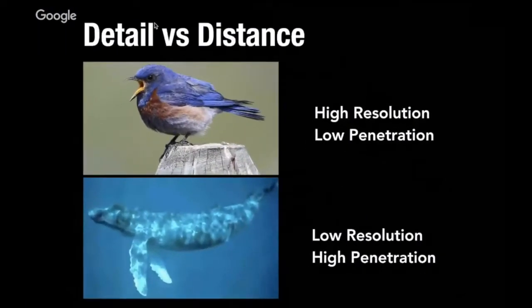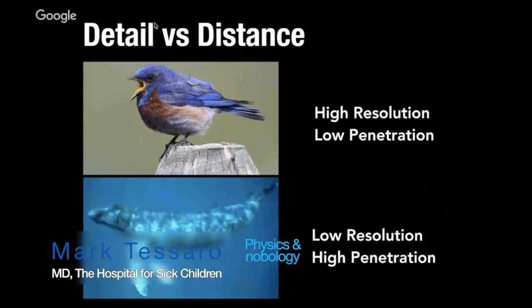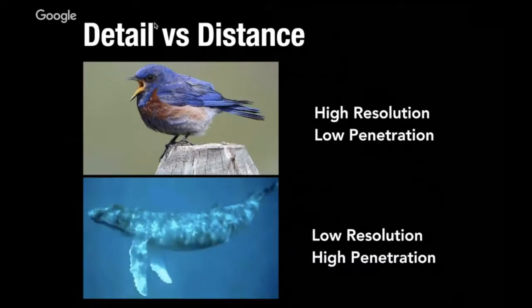And as we move on to the probes and the choices of what we use and their different frequencies and what that means, why a high frequency probe, why a low frequency probe, animals are a good way to understand the differences in different frequencies of sound.